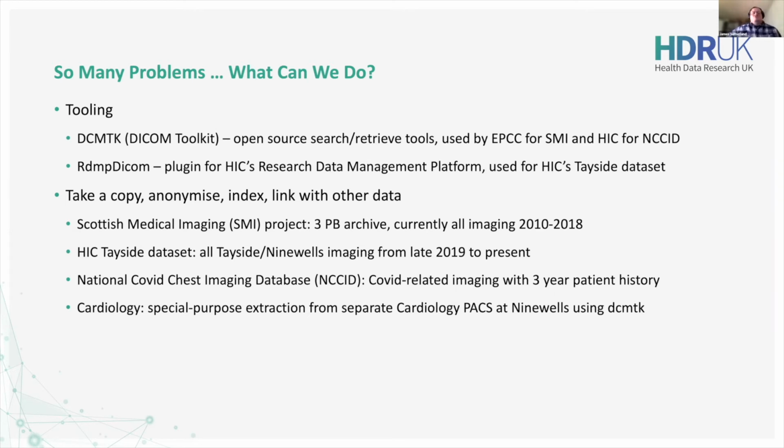And the biggest one we have is the SMI, Scottish Medical Imaging Project. That's an archive of something like 3 petabytes of raw DICOM images pulled from the Scottish National PACS system, spanning 2010 to September 2018. And there's work ongoing to bridge the gap between that and now.